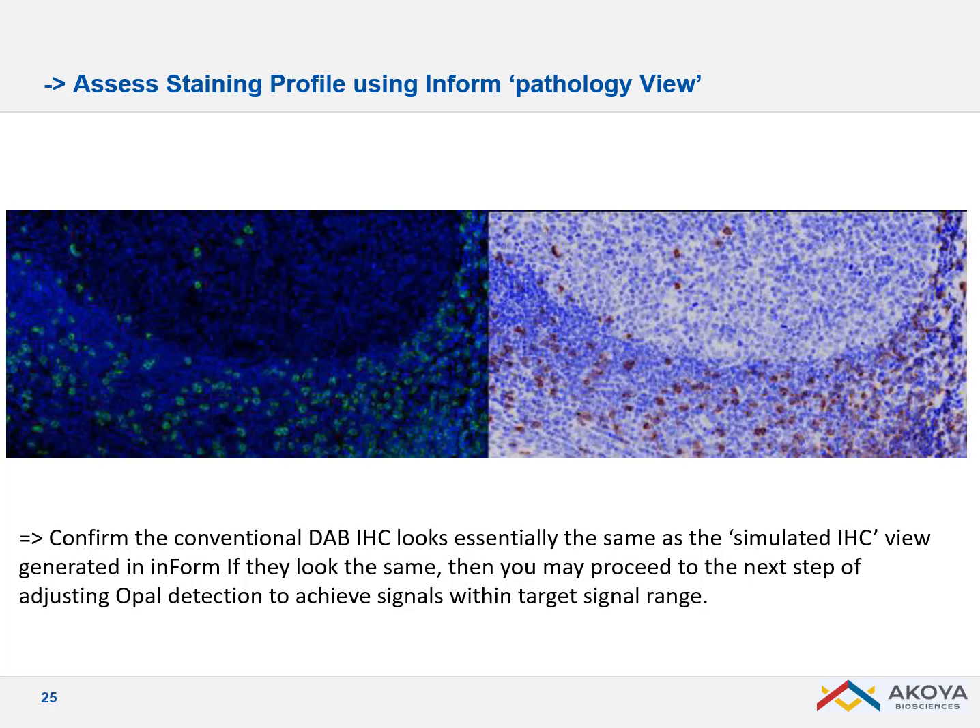A really useful feature in InForm is that you can mimic a DAB staining from your fluorescent tissue section. For example, with OPAL 520 in fluorescence, you can reproduce a DAB staining where DAPI acts like hematoxylin and OPAL 520 is represented as DAB. We call it a pathology view, which lets you compare what you get using OPAL with what you used to have using DAB.